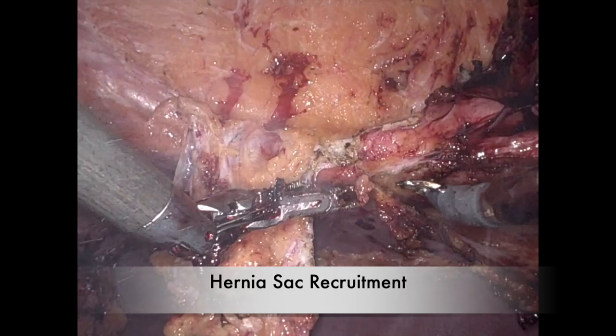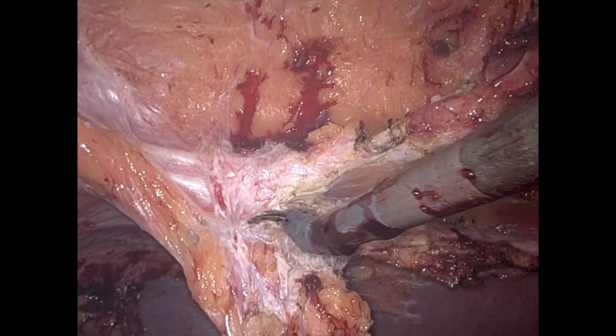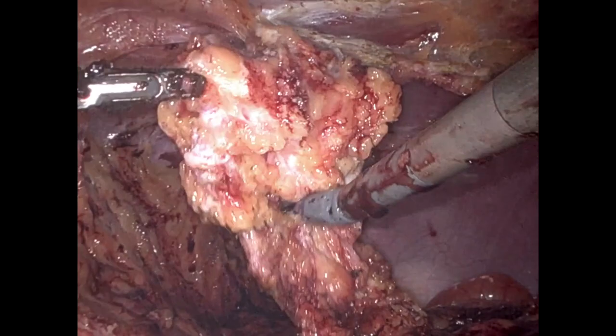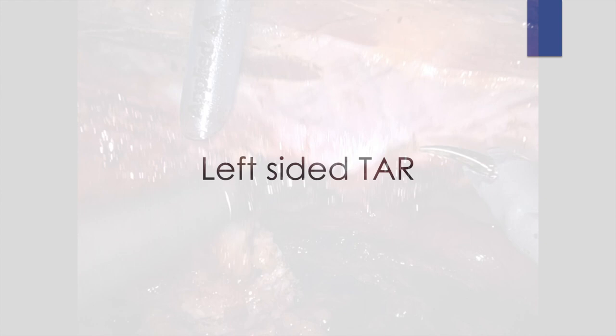Here I'm highlighting an important element of any of these procedures: the concept of hernia sac recruitment. Early in the case, I like to preserve as much autologous tissue as possible to facilitate posterior sheath and visceral sac closure. In this particular case, we recruited this sac but did not end up using it, as we were sufficiently able to mobilize the posterior sheath and peritoneum with our bilateral TAR.